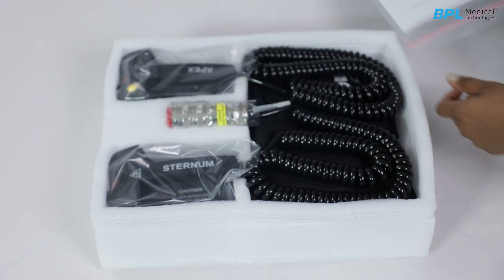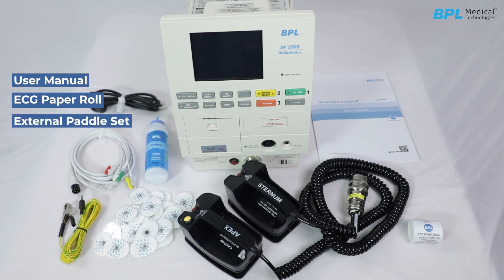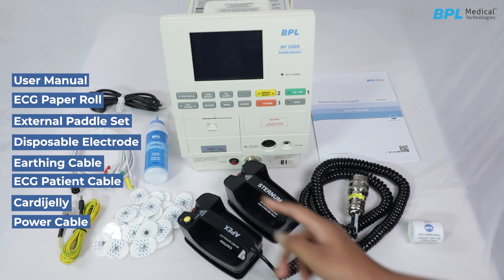The standard accessories provided with the machine include: user manual, ECG paper roll, external paddle set, disposable electrodes, earthing cable, ECG patient cable, cardiac jelly, and a power cable.